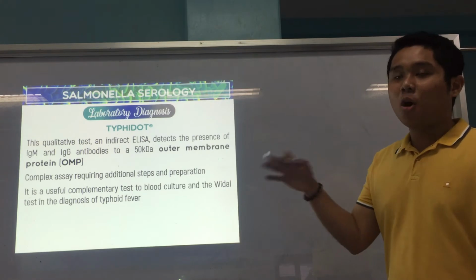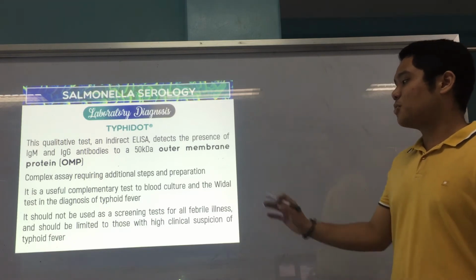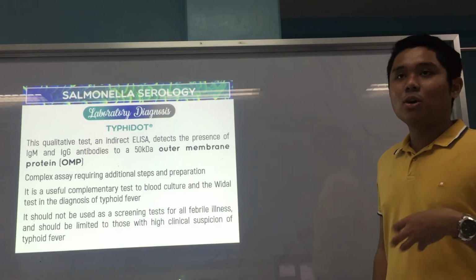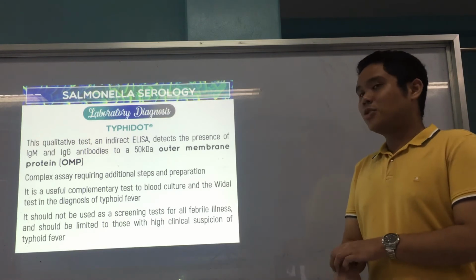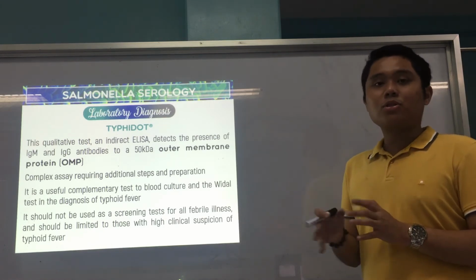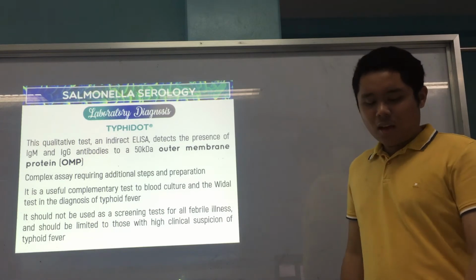So pwede siyang complementary test lang yun. But it's not used as screening test for all febrile illness and should be limited to those with high clinical suspicion lang of typhoid fever. So when we say febrile illness, again, those experiencing fever, presenting with fever. Okay. So Typhidot should not be performed in all, but only those patients that are suspected to really have typhoid fever. Okay? Alright.